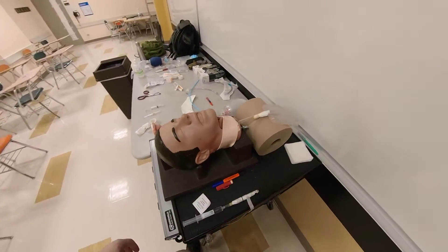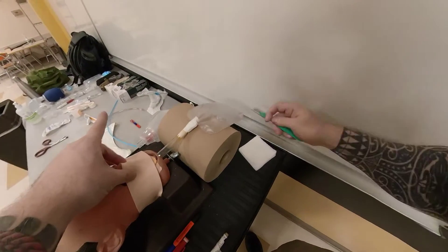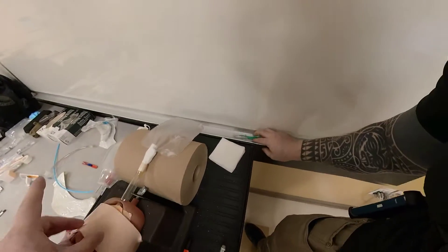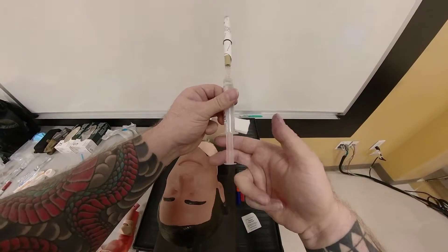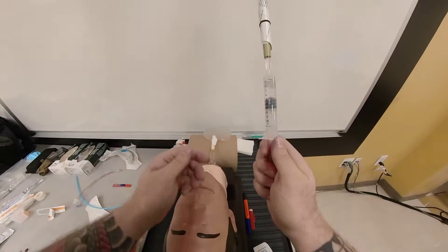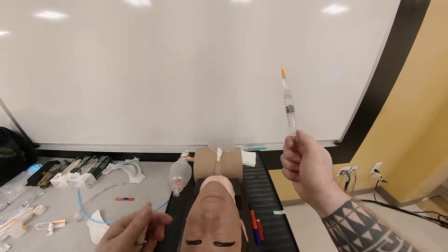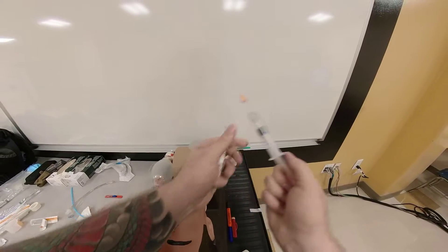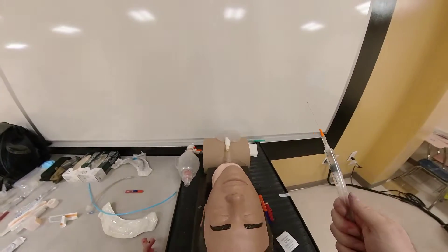Unlike surgical cric where I stand on the patient's right, stabilize, and cut with my scalpel down and to the side, here I'm actually going to be standing at the backside of the patient because I'm going to be holding the syringe with two fingers and my thumb up — giving like a thumbs up sign. As I'm advancing, I'm pulling back up. Another way to hold this is with your middle and next finger here, and use your thumb. I find the thumbs-up position way more comfortable.